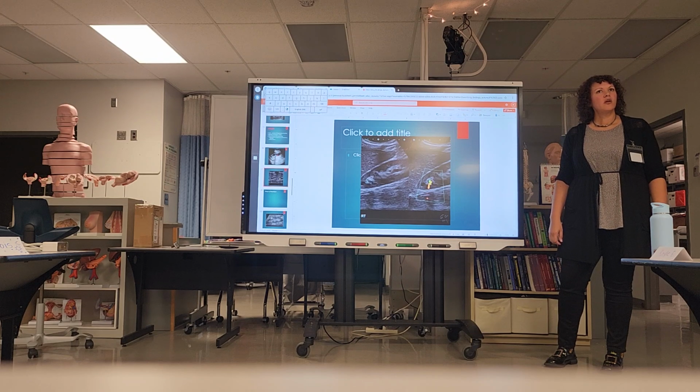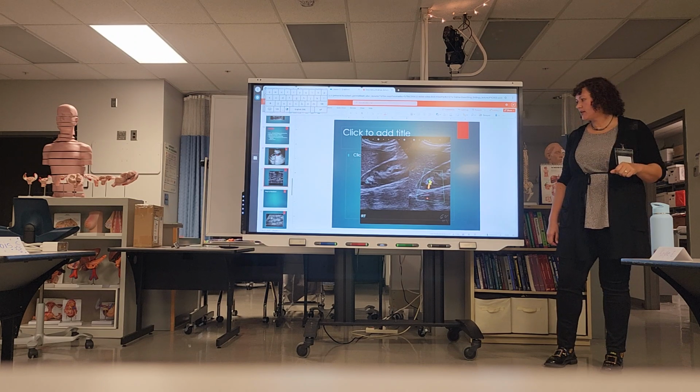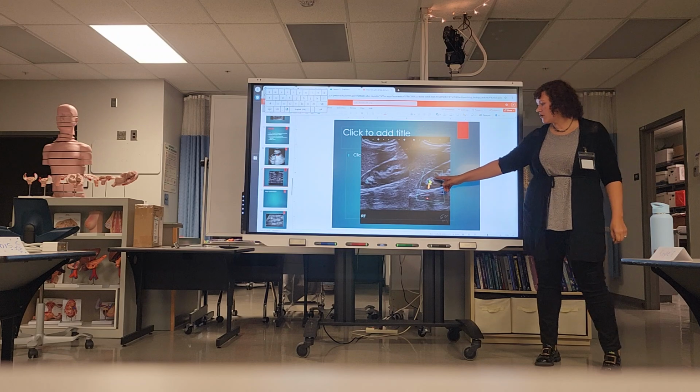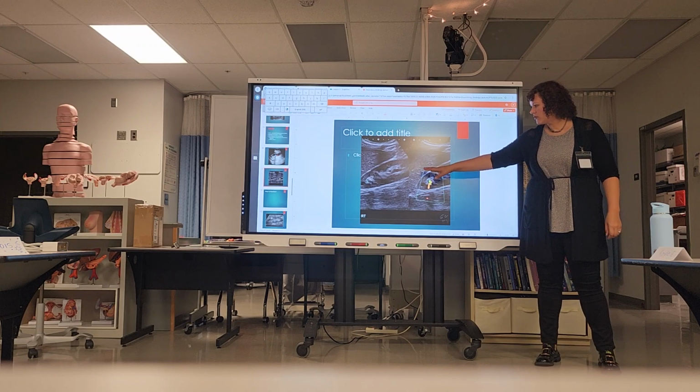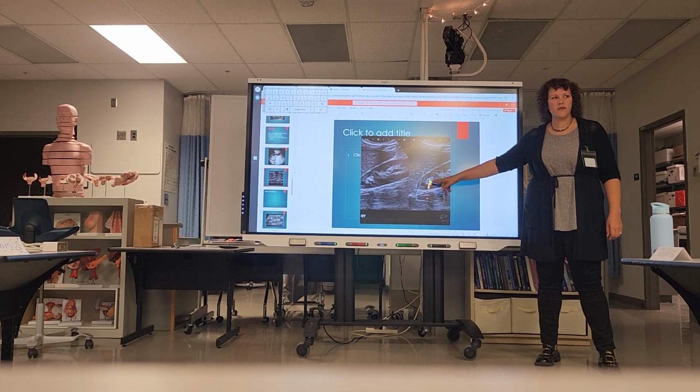Gallstones, I don't think that they twinkle. There are other things in the gallbladder that will twinkle, like air. I can't remember what it's called, pneumocystitis or something like that. So you'll get this artifact in your kidneys, and then over air, you'll get this artifact.